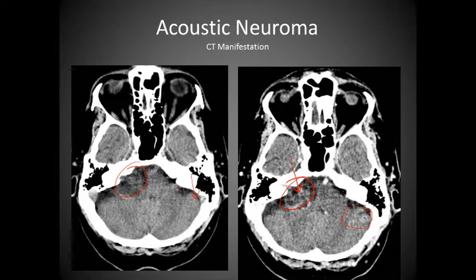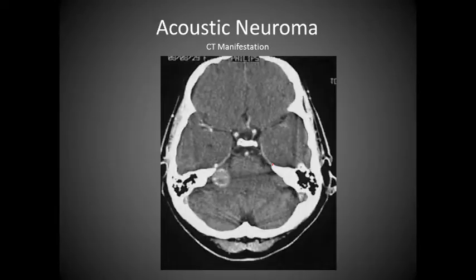Notice how very underwhelming the contrast enhancement is, but there is slight contrast enhancement. The reason it's very hard to distinguish is because we have all of the lines that are running here due to the increase in density in this portion of the skull. So it's very hard to really distinguish anything in this image. That's why MRI is utilized to a higher degree here.